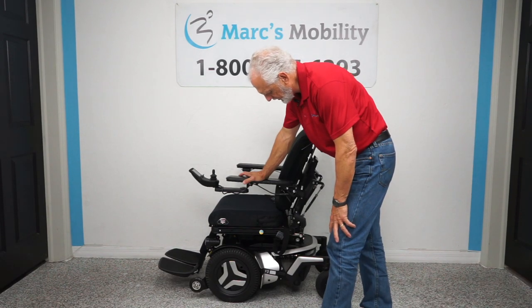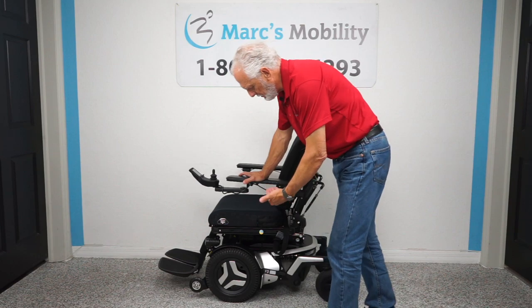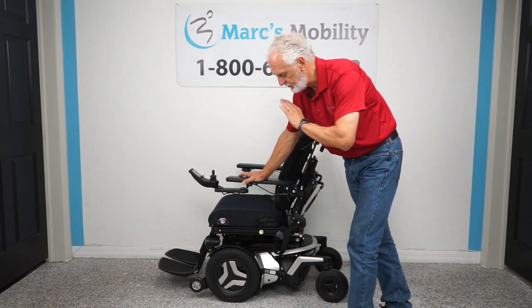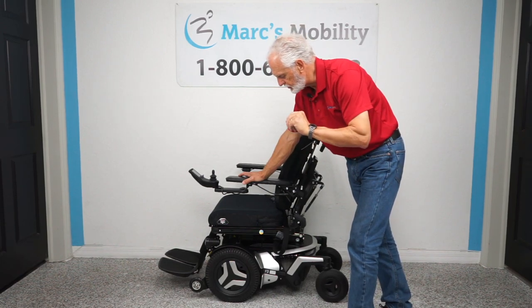Hi folks, we have a beautiful Permobil F3 here — front wheel drive, metallic silver. This chair only has 2 miles on it, literally brand new, fully loaded with 5 electrical functions.